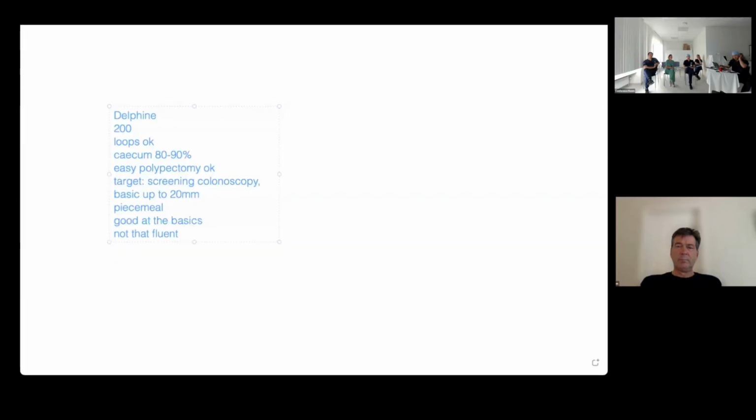So when we have a patient, which I think will be quite soon, which patient is the last patient? So your wish looks like it's about to become true, because this patient has what looks like a 20 millimeter polyp. It looks a bit smaller to me than 20 millimeters, so a 15 millimeter polyp, even better for you, at the hepatic flexure. It's non-granular, so that's always fun. And according to my piece of paper, nothing else. It's possible that there's many other things in there to be found today, but you just never know. Okay.